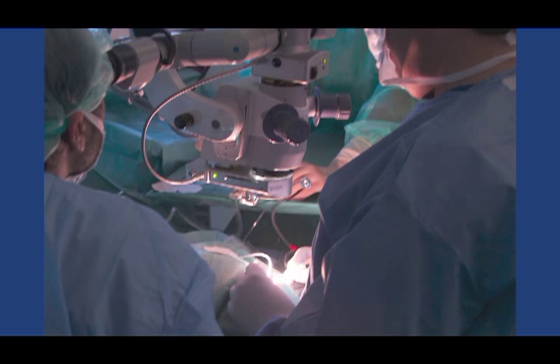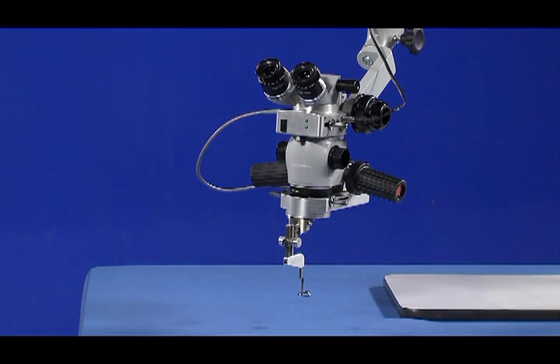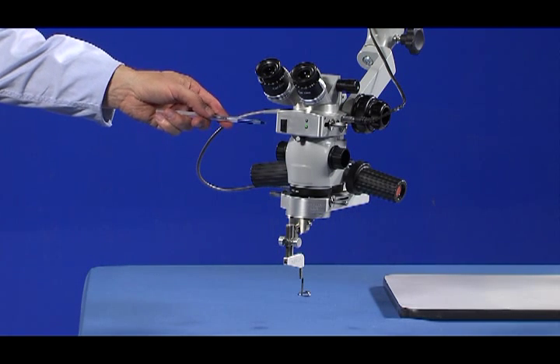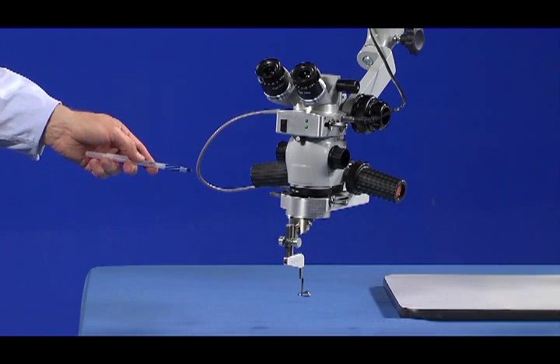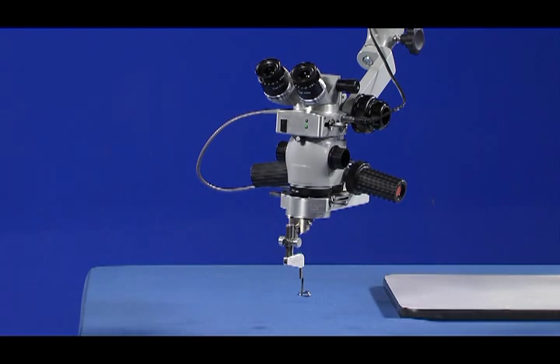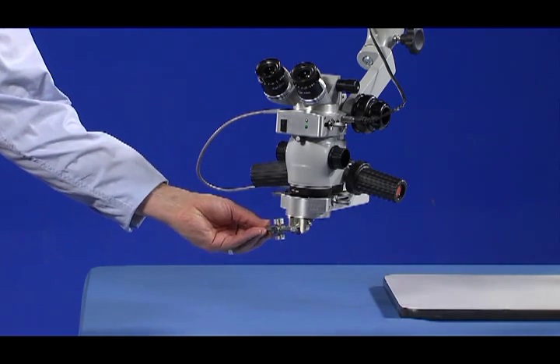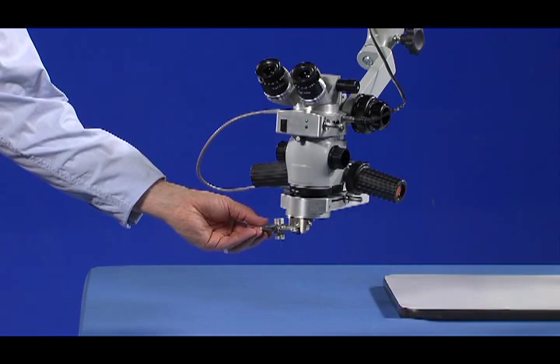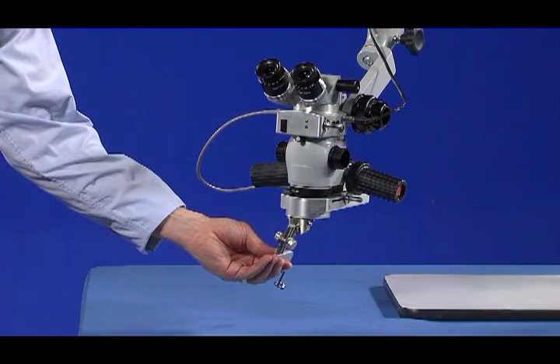The Roles Infinity is available in models that fit either a Zeiss-style mounting configuration or a Leica Wild-type mounting configuration. Additionally, the Roles Infinity is available in an automated configuration or a manual configuration. The automated models can be connected directly to the automated Merlin CLA models to provide power to the CLA and synchronized actuation for both devices based on the position of the LPU and lens attached to the CLA.